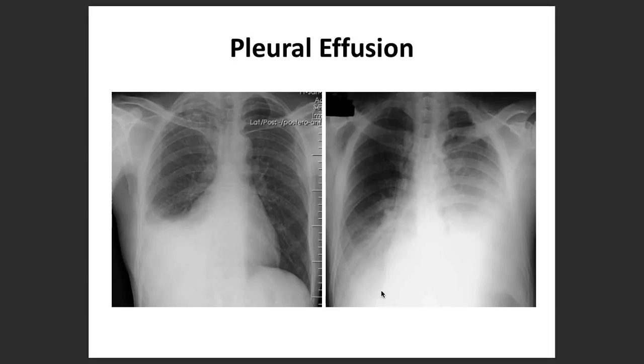The other thing is, can you also comment about the amount of pleural effusion? How much ml is it? Is it mild or minimal pleural effusion, moderate, or very severe? Even with the X-ray, if you are able to determine the pleural effusion only in chest X-ray lateral decubitus, it is going to be 10 to 50 ml.